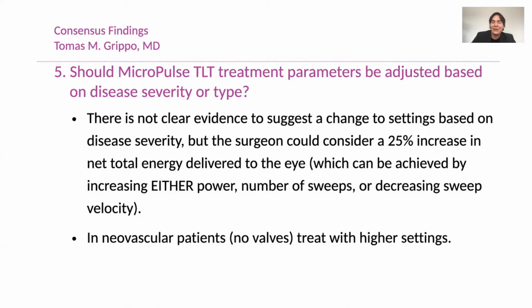So do you have any predictors? Do you have any idea like who's going to have pain with this procedure? Because I think most of us agree post-op is really not much usually, but there are some people. Do you have any feel for, or are you good at predicting who might have pain post-operatively? Not really. I mean, there are some patients that just have a low threshold for pain, so you can kind of predict that they may have pain.